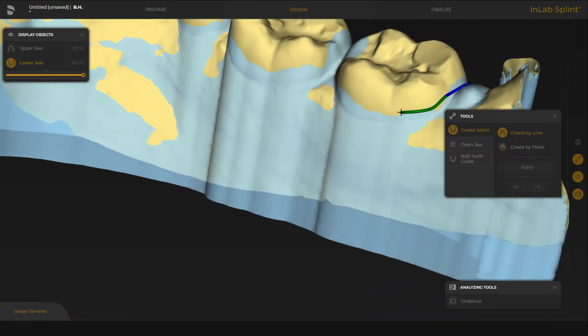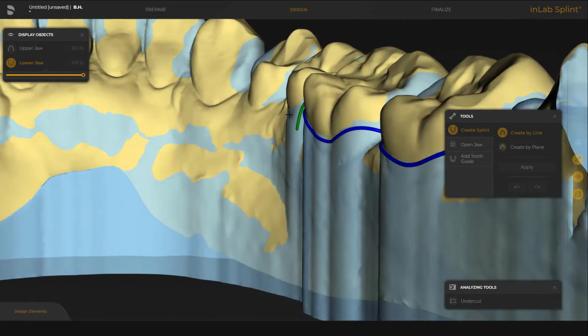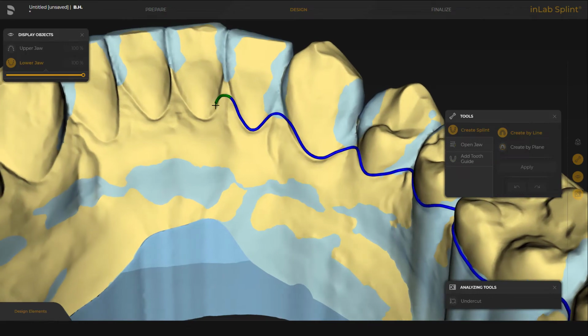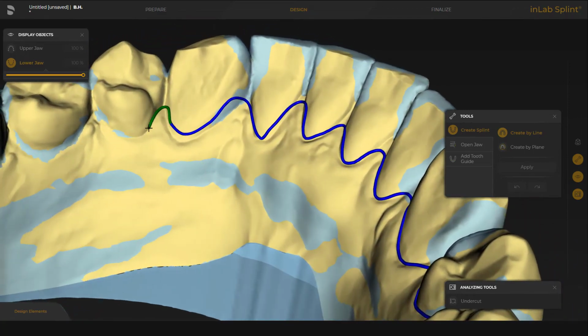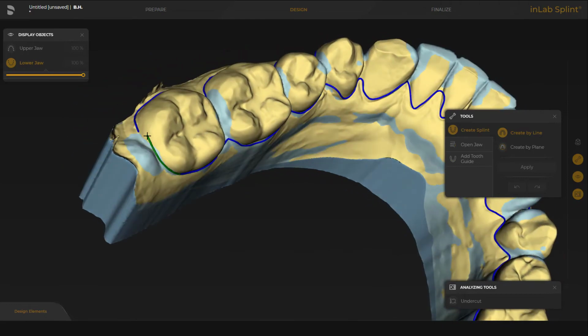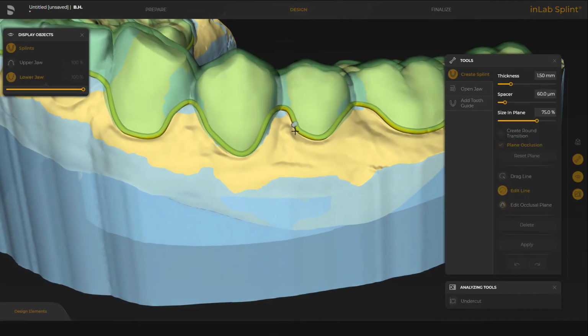So now we will come into the blocked out area. So here I try to stay a little bit below the blue area. So the splint will not stay in the air, and this could cause a weird feeling with your tongue while you're touching the splint in the mouth. Same here on the third quadrant. And double click to finish. So in case you want to realign your line, you could do so by just starting with a double click and then correcting it and double click to finish the line back.